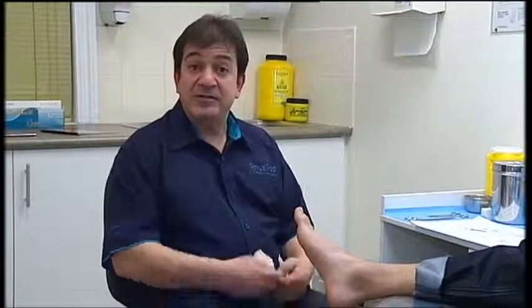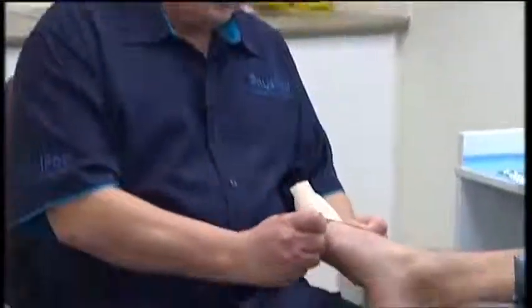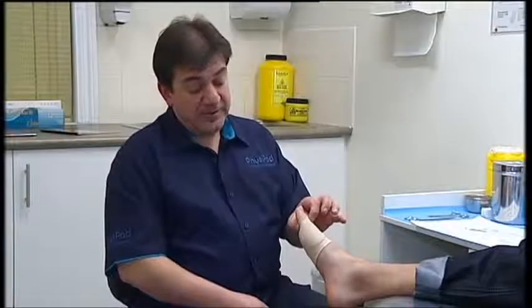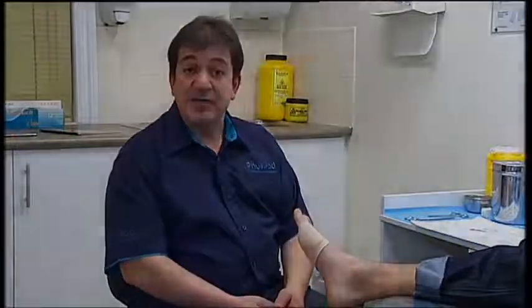Very simply, application is over the forefoot, covering the big toe and placing the disc over the affected part.